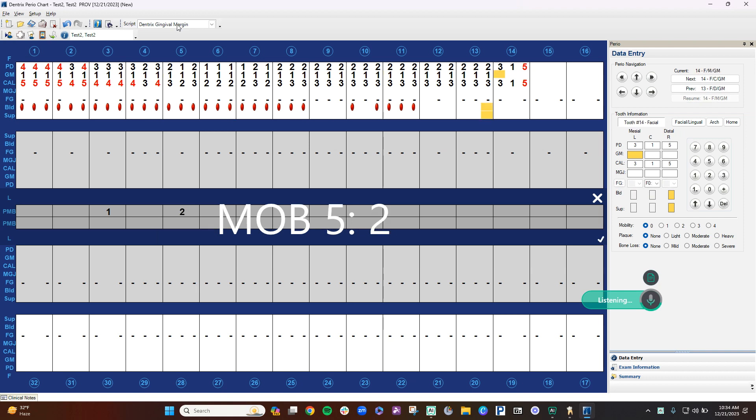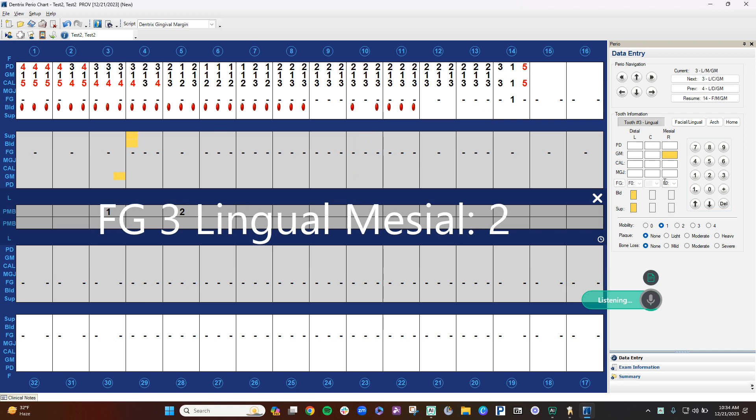Furcation 14, buckle, grade 1, furcation 3, mesiolingual, grade 2, 1-2, save chart.